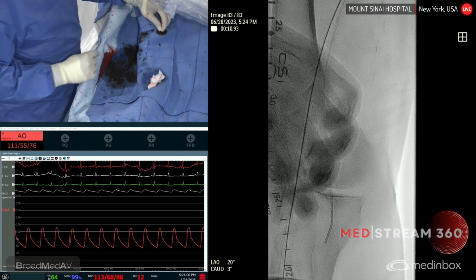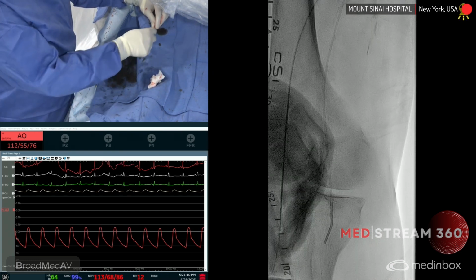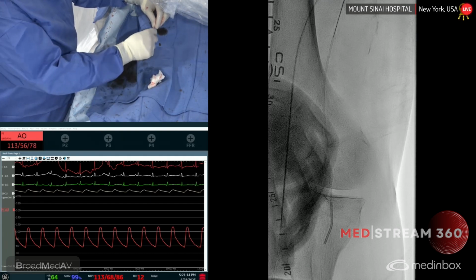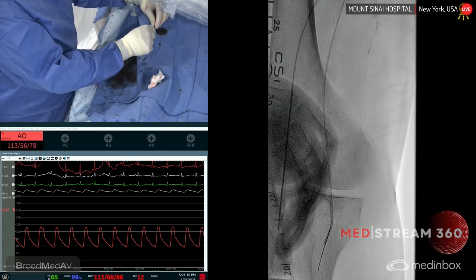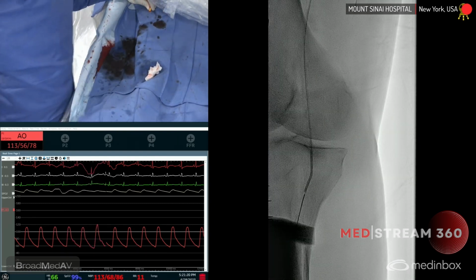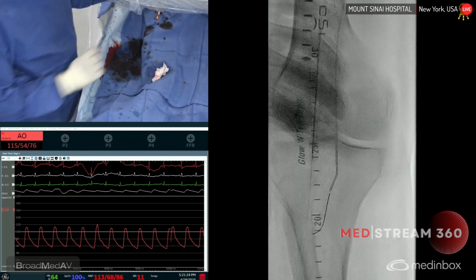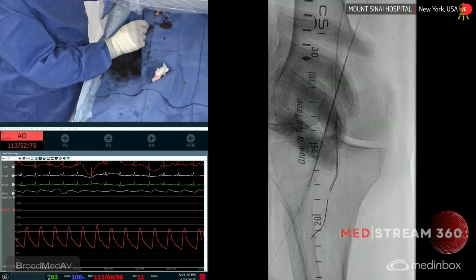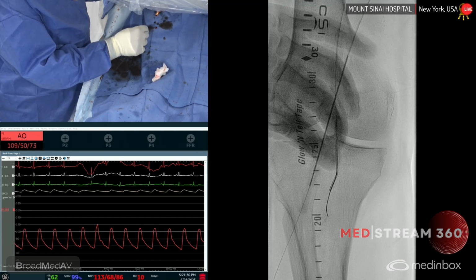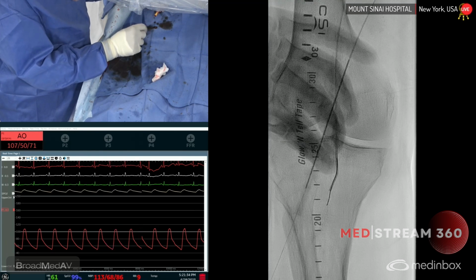The proximal part of the wire has a little golden nugget on it that prevents the filter from migrating. The beauty of this wire is that the movement of the filter is independent of the wire, which prevents the filter from moving while you're doing complex interventions with atherectomy and so on and so forth.